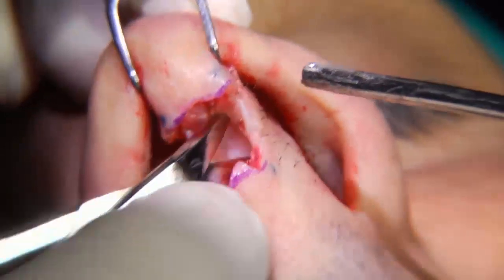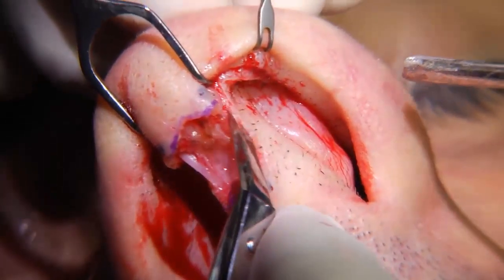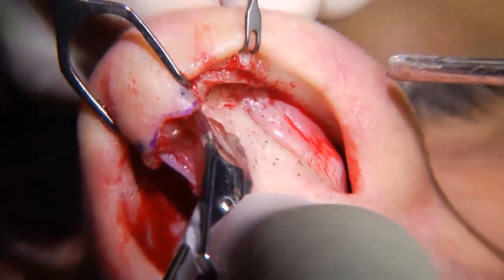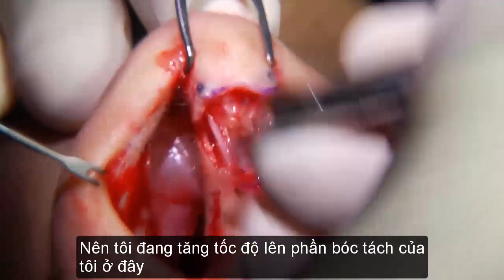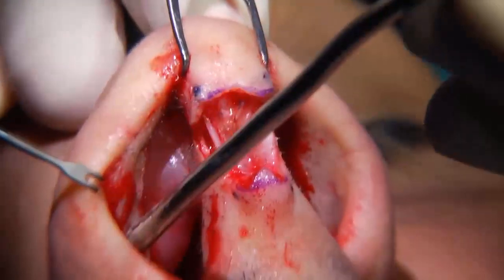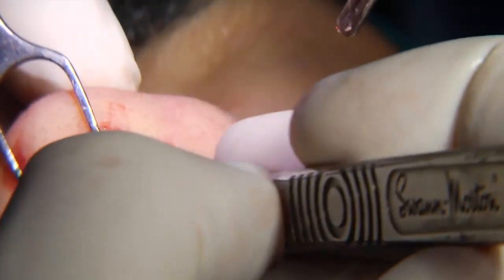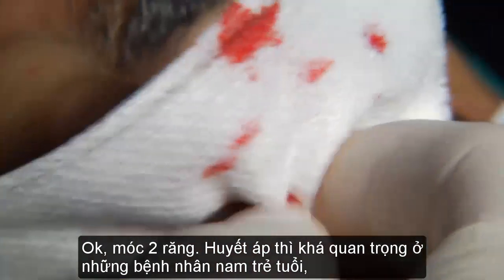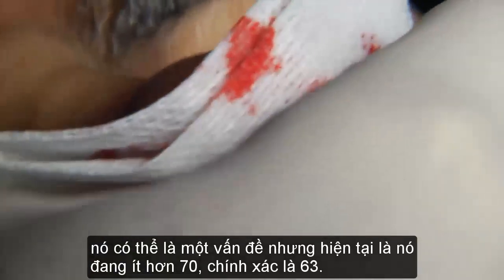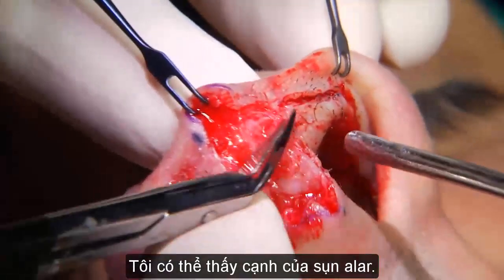I thought you wanted to save some medial crura from the damage of the first incision. Oh, that's okay. No, Wolfgang. Ah, yes, yes, for this incision. So I'm already speeding up things by some dissection here. All right, double hook. Blood pressure is so important. In young males it can be a little bit of a problem, but now it's less than 70, 63 actually. I can see the edge.